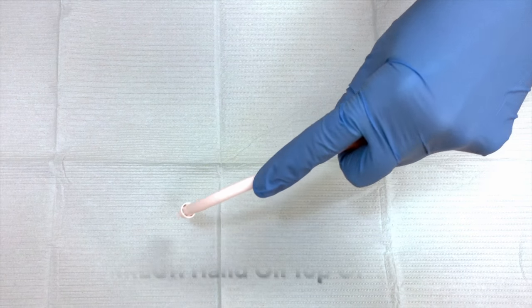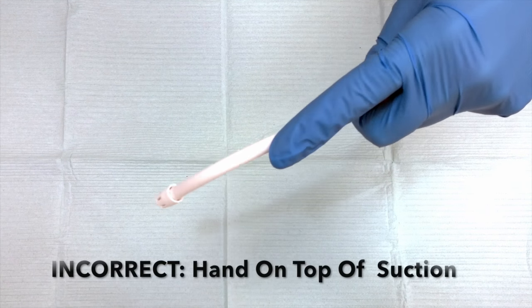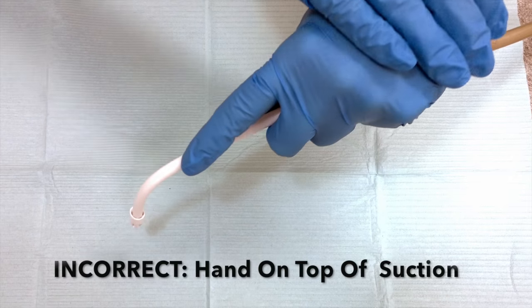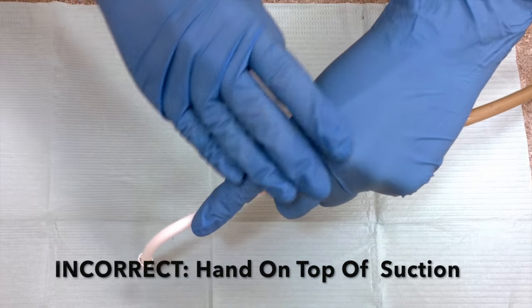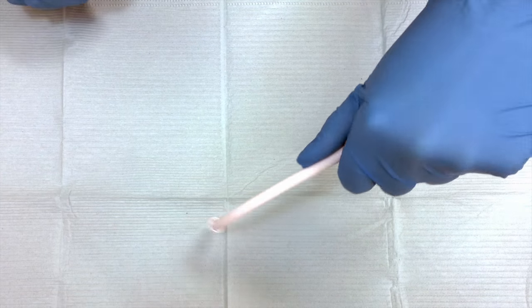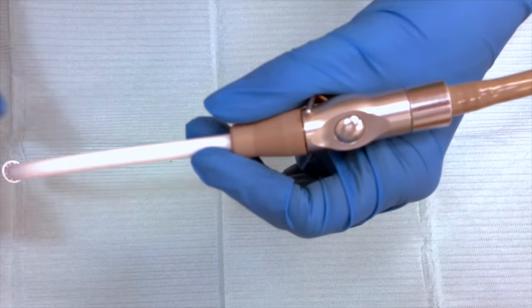Generally, when we use a suction to either retract the cheek or to actually section, we'll put our finger or hand above the suction or on top of the suction. This puts a lot of strain on our pointer finger and our wrist of the non-dominant hand throughout the day.